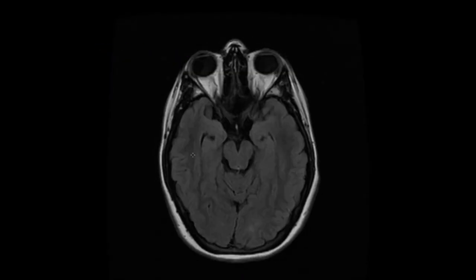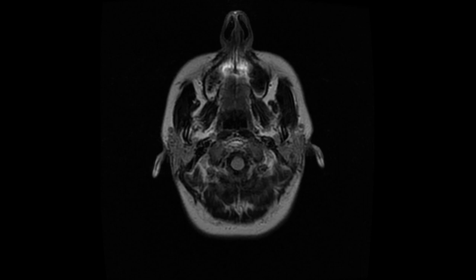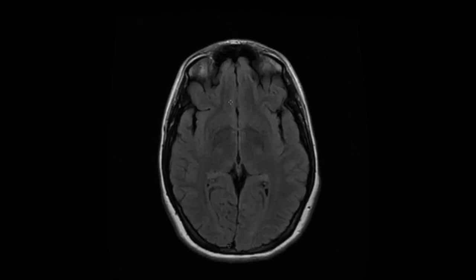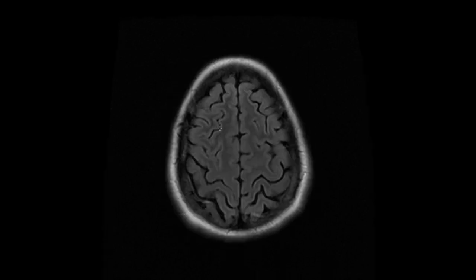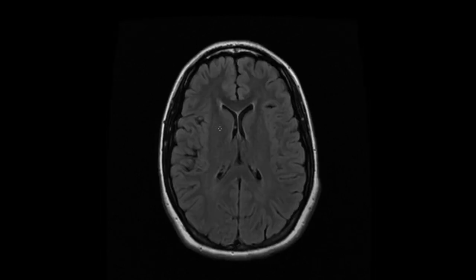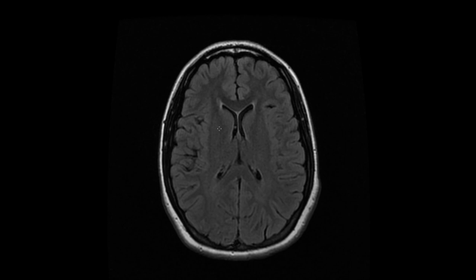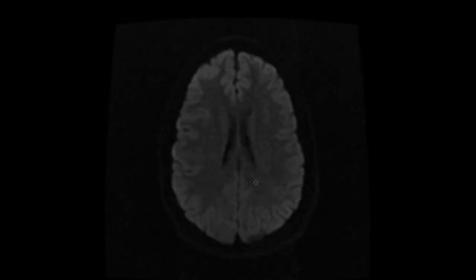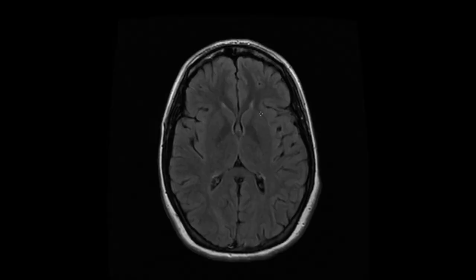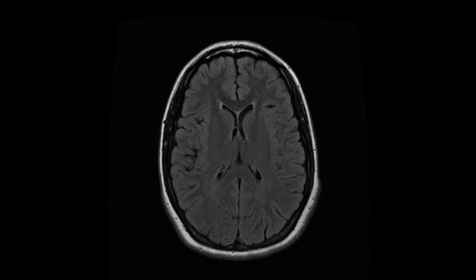Moving on to the FLAIR — this is the FLAIR image. It should be done immediately as one of the first three sequences to start. If there's a stroke, you'll see a big white piece or dots within the brain. Depending on the severity of the stroke, it'll be a larger or smaller piece. This scan has a very high TR and a high TI, so it does take quite a bit of time, but it is very informative. Here's the DWI — it usually takes around 30 seconds to a minute. If there's a stroke, you'll see it in the same spot as a bright spot on both DWI and FLAIR. If it shows up on the DWI, it's likely a new stroke; on the FLAIR it'll stay there. That's why you do both together.